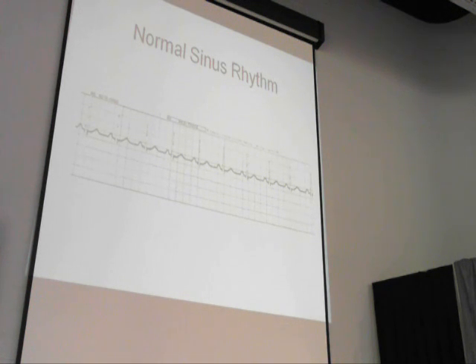What are we literally looking at? When we look at a monitor or a printout of the EKG, what are we looking at? A picture, or a graphic illustration, of the electricity. That is it. The heart has two basic functions. Electrical makes the mechanical. That's one of the unique things about cardiac cells. They make their own activity and respond to it. If the electrical isn't good, the mechanical isn't going to be good.